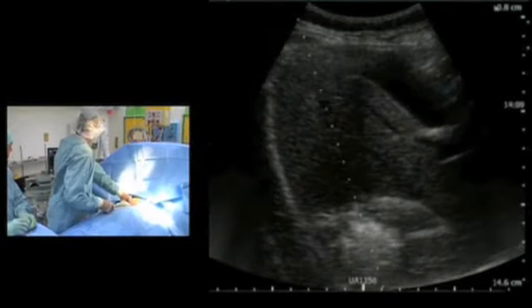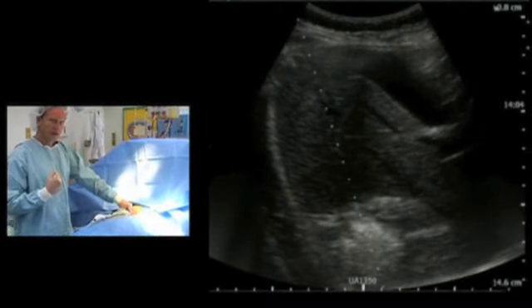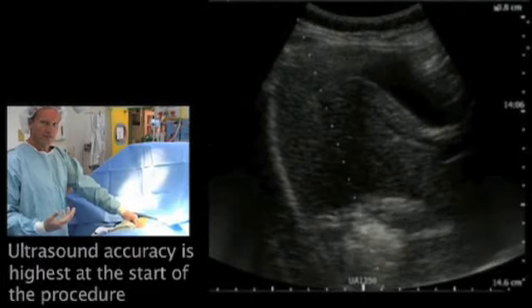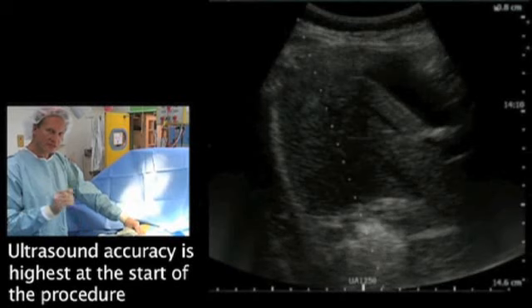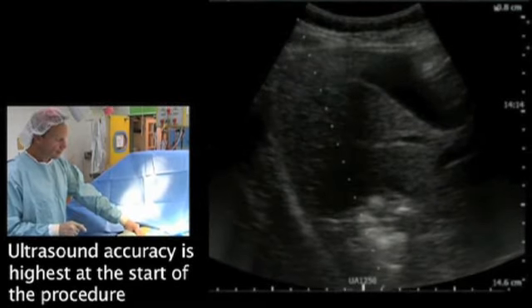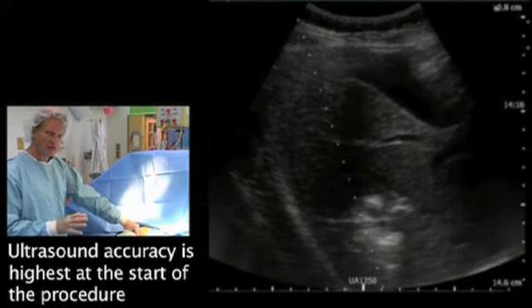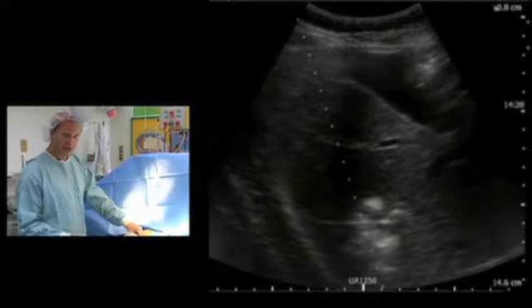You can also see the more we are treating on the ultrasound image, the more blurred it's getting. So it's very, very essential to use the ultrasound for a precise positioning of the needle in the start of the procedure. You cannot correct it with the same accuracy during the procedure as you can place it correctly in the start of the procedure.